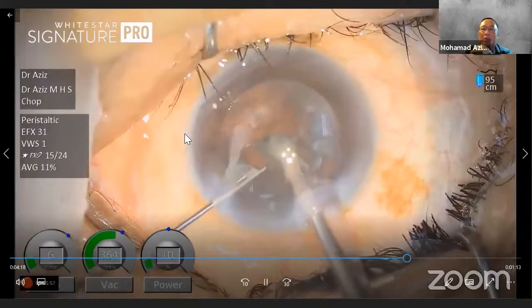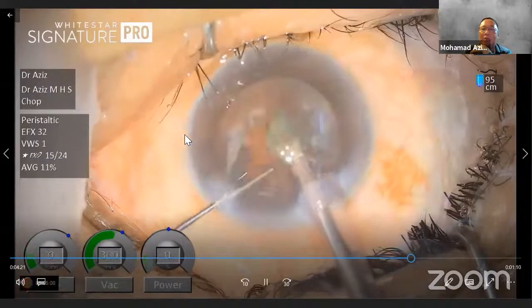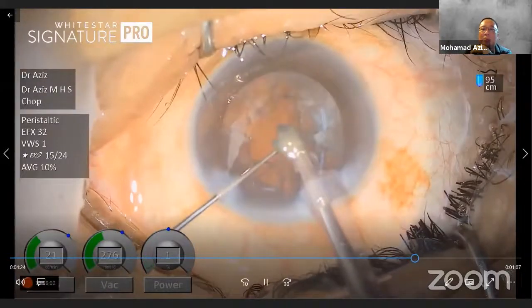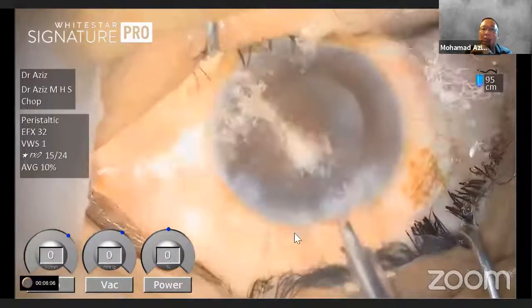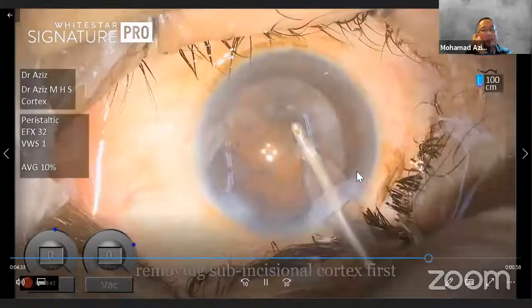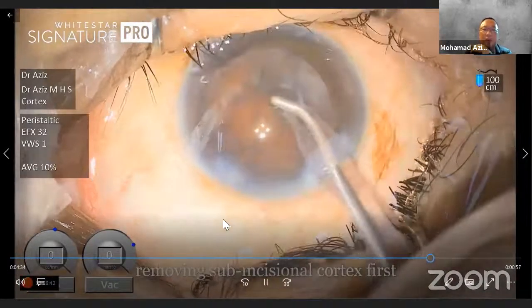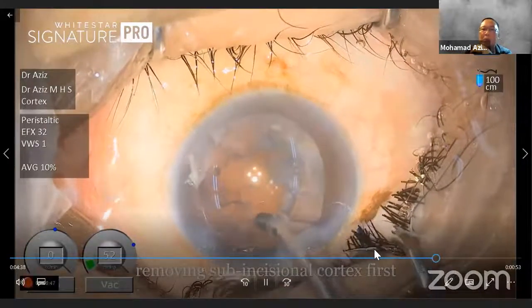So this is fully controlled by the foot pedal. As much as you move the foot pedal determines your power, how much it consumes. Okay guys, about the Faco burst and Faco pulse just now, you all have to read up on that. Okay, any other questions? 85 already.